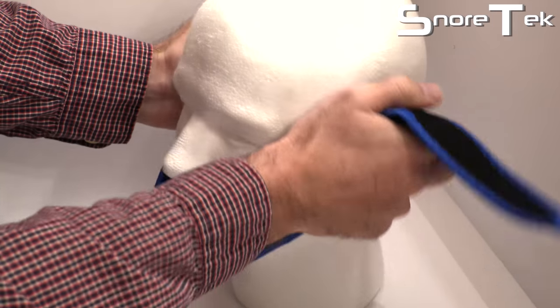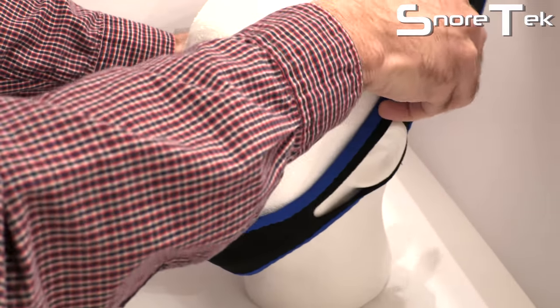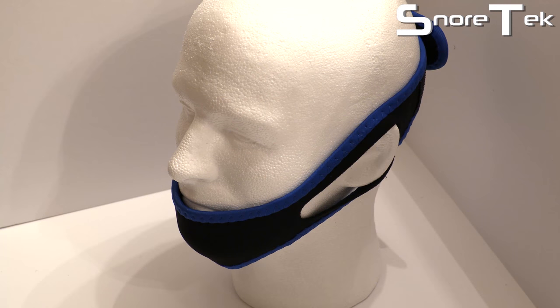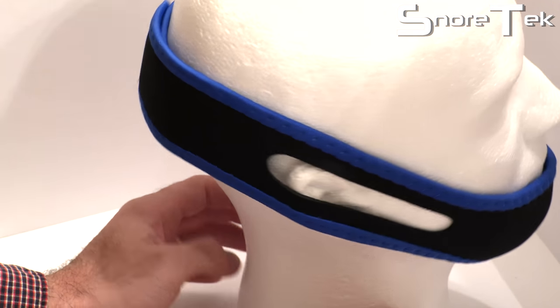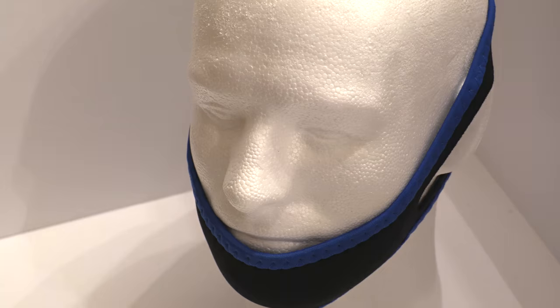To fit the Snortec Chin Strap, simply place the strap on your chin and then connect the velcro behind your head. Make sure your ears fit in the spaces on each side of the Chin Strap. Once the Chin Strap is attached, it will keep your mouth closed while you sleep, preventing snoring.